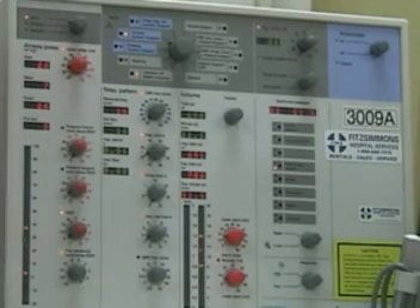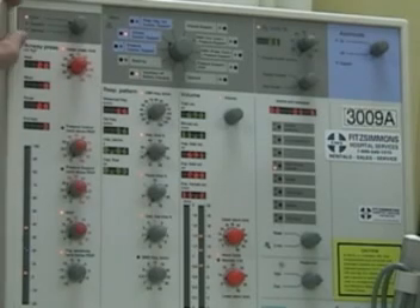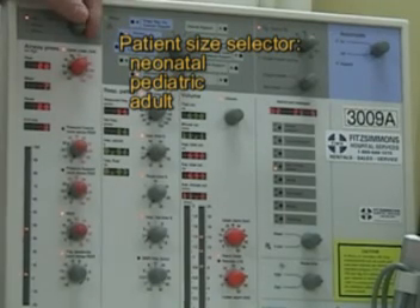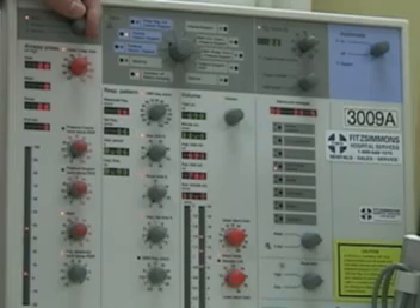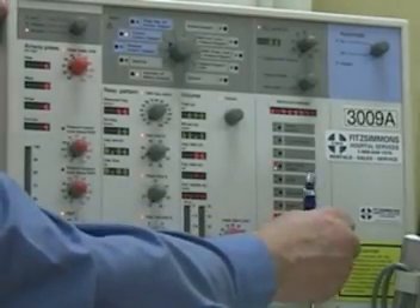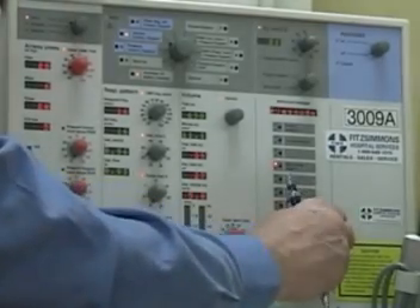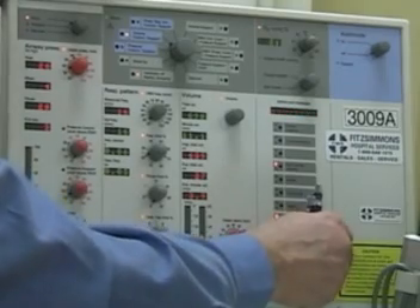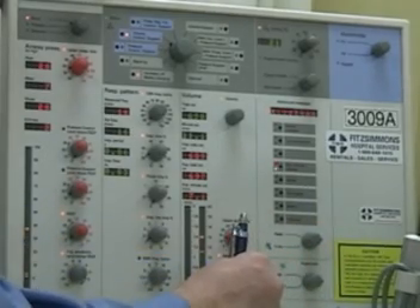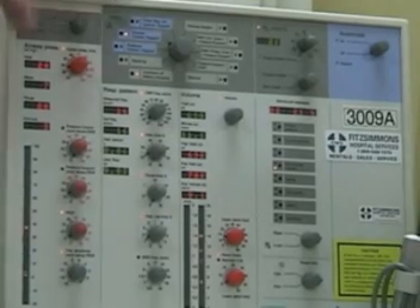There are columns of information on the 300 ventilator. This column starts with the neo, pediatric, and adult selection, which sets your ranges and alarms. In neo mode the alarms are much different than in adult mode, as is the delivery of ventilator parameters. Changing this setting also changes the configuration of the volumes that the patient receives.